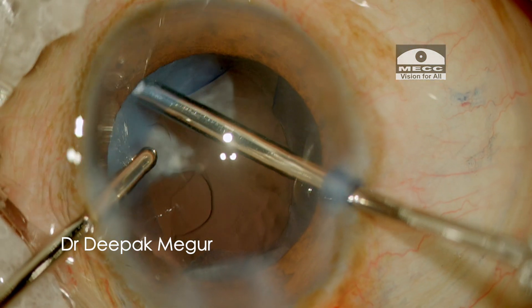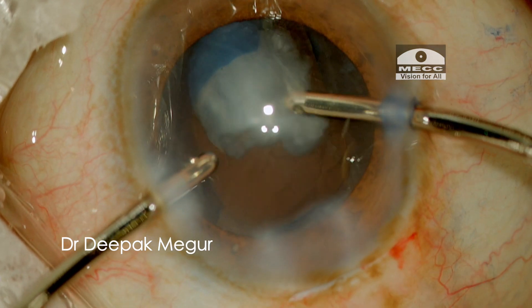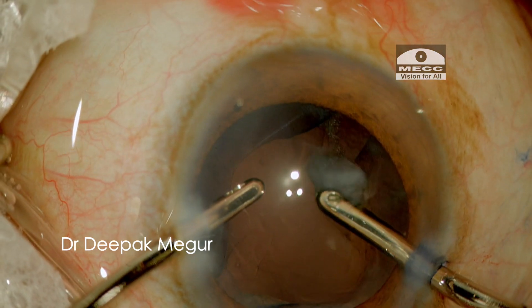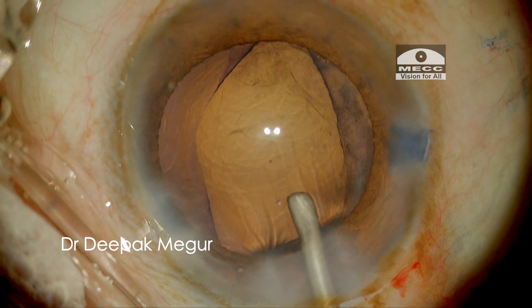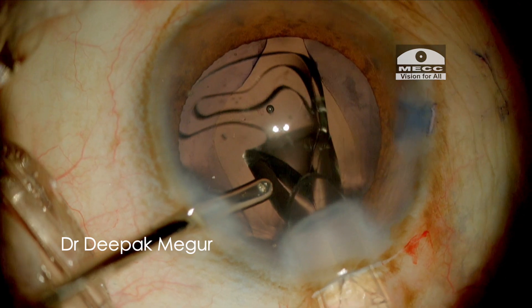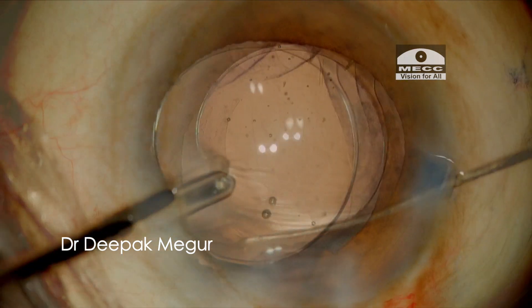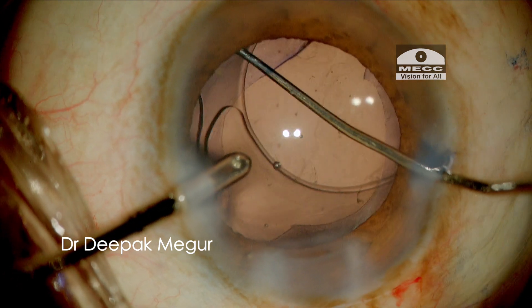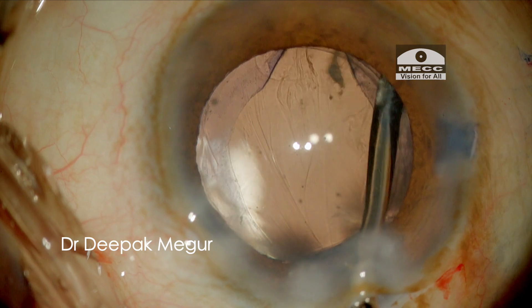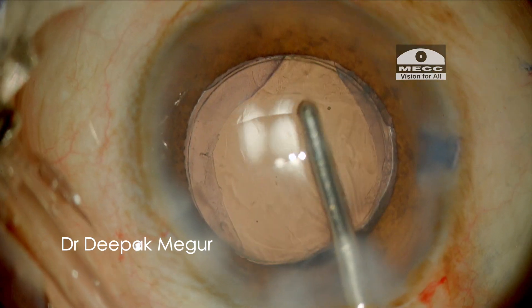Now is the time to remove the cortex, and again we can see clearly that the capsule flap is everted and fluttering, which is a good sign suggesting that all is well so far. In this case we had actually planned a hydrophilic IOL, and hydroimplantation is my usual technique when implanting these lenses, but in this situation I consciously avoid the technique. Here I am implanting this lens after filling the bag with OVD — morally it is better to be safe than sorry. The lens is oriented so that the haptics are perpendicular to the axis of the radial extension of the anterior capsule. The OVD is then removed both in front and behind the lens. I am not so aggressive in removing the OVD behind the lens this time, just to avoid any extension of the capsule tear.